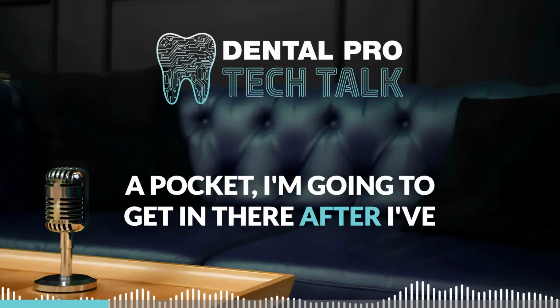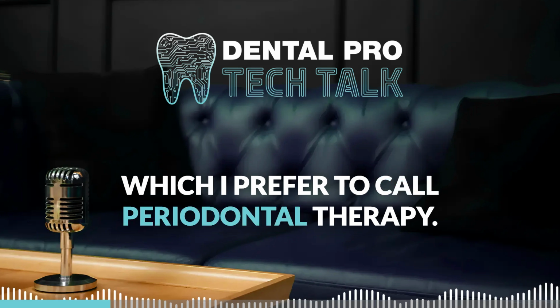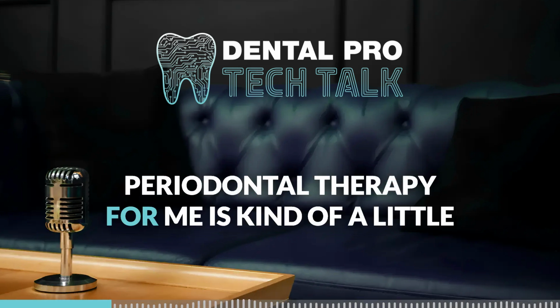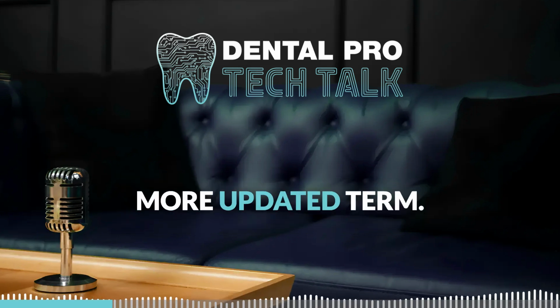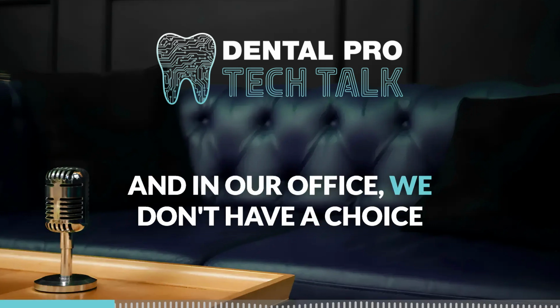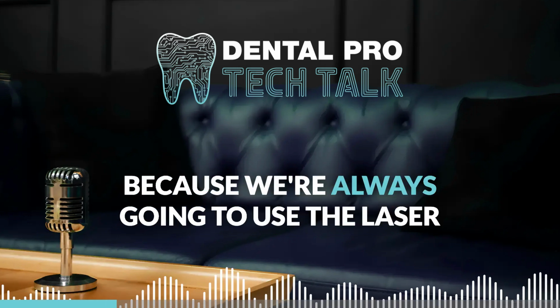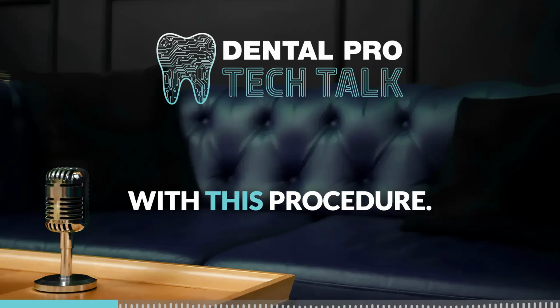I'm going to get in there after I've done my scaling and root planing procedure, which I prefer to call periodontal therapy. Periodontal therapy for me is kind of a little more updated term than what scaling and root planing is. And in our office, we don't have a choice of using the laser or not using the laser because we're always going to use the laser with this procedure.